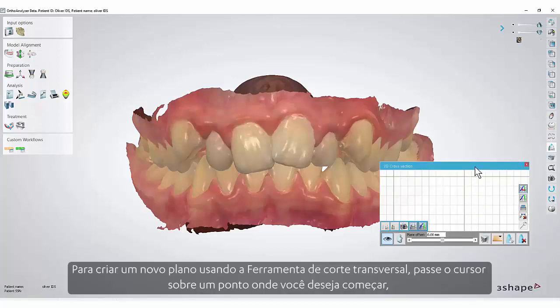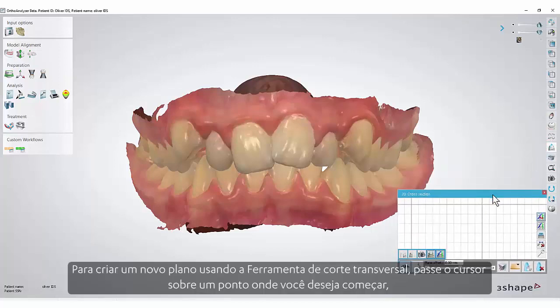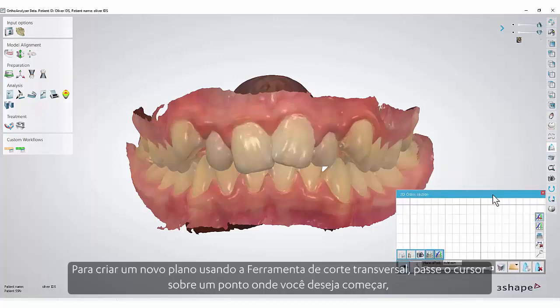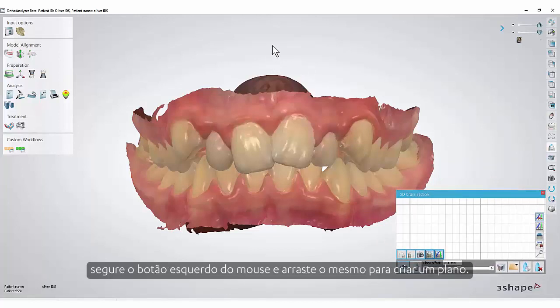To create a new plane using the cross-section tool, hover the cursor over a point where you wish to begin. Hold the left mouse button and drag the mouse to create a plane.